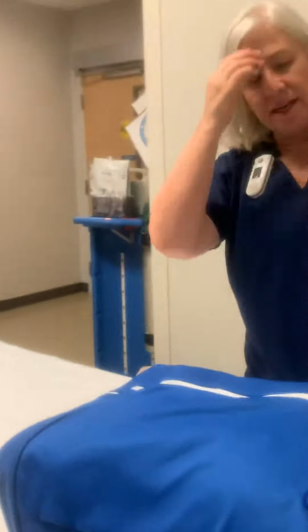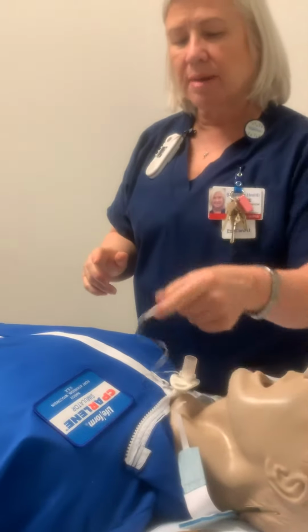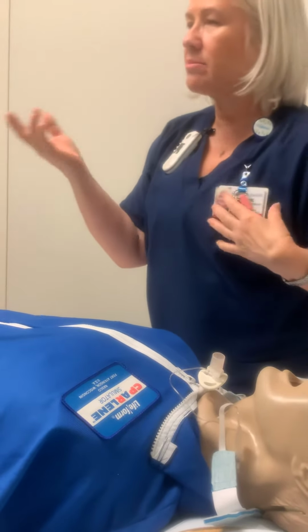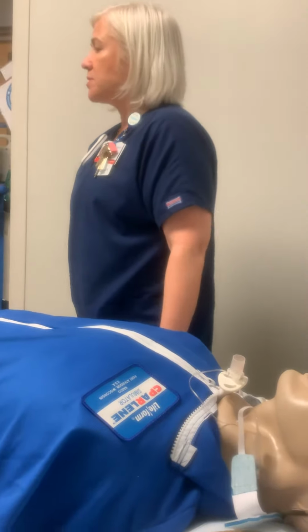Suctioning. The other thing real quick here, we'll talk about cleaning the trach. Make sure that you clean these little crumbs, I call them crumbs, they're like scabs or things that have built up. Keep them cleaned off from that trach because they can slip into the trach. So you want to keep those cleaned up.